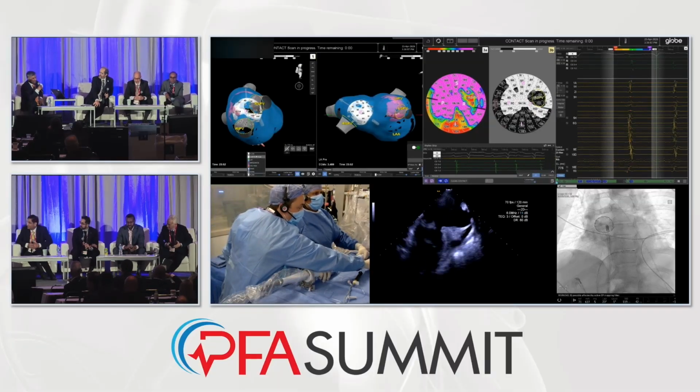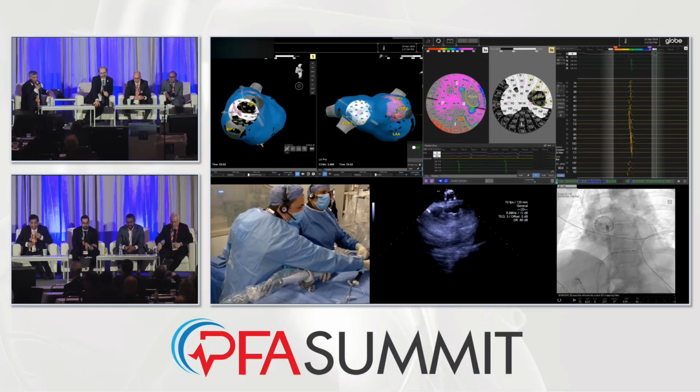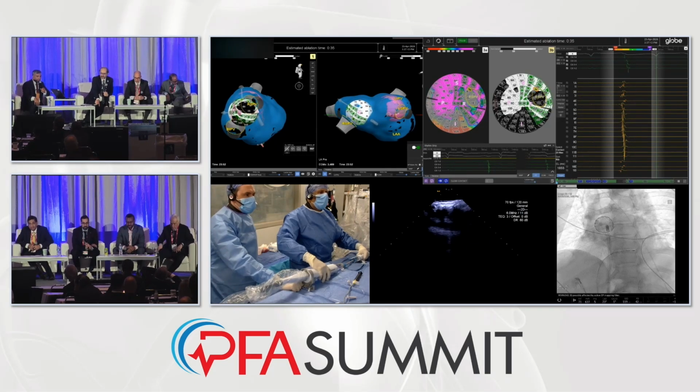Well, you could ask that about any technology, I suppose. Look, this is a reasonably versatile system. Let Srini show the contact here. You guys can see it up there in that top right bullseye. And then you're going to run a contact. That is a contact scan, right? Yeah, this is the contact scan.